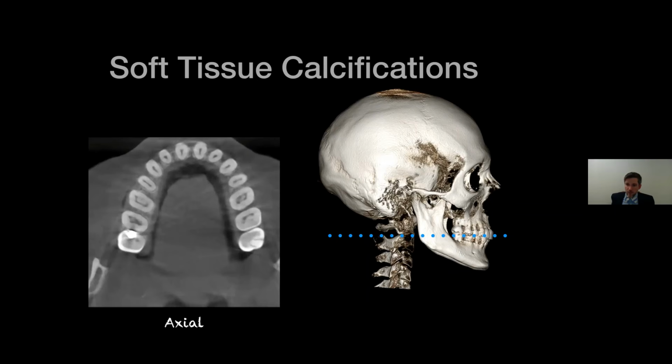But if you do write the code for capture and interpretation, it does include that report, and that could be done by you. It doesn't have to go to a radiologist necessarily.